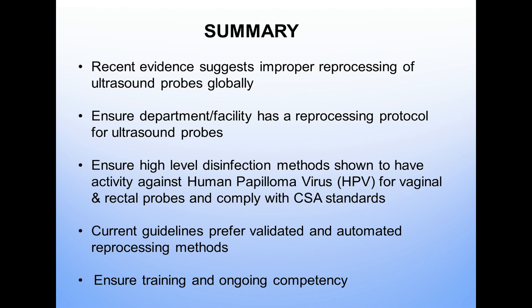For a number of years, I think there was a group within the healthcare organizations that felt that HPV could be transmitted through vaginal and rectal probes, and as well some GI endoscopes. But it didn't become widely known until the last 2.5 years, when there's been some more research.